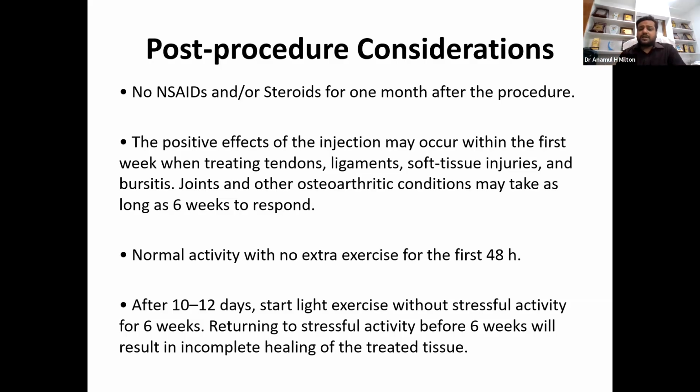The positive effect of the injection may occur within the first week when treating the tendon, ligaments, soft tissue, and the bursa. For the joint and osteoarthritis, it may take up to 6 weeks to respond.